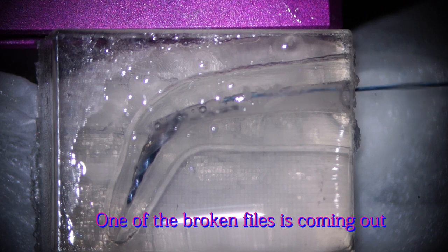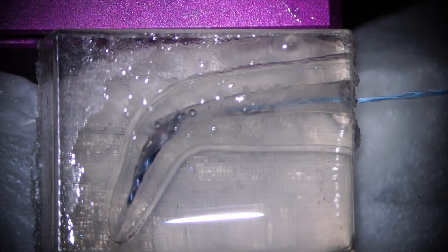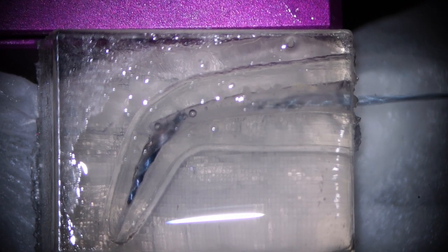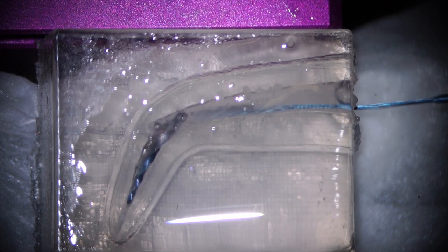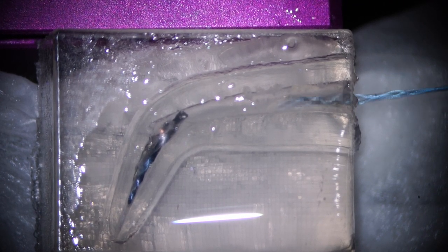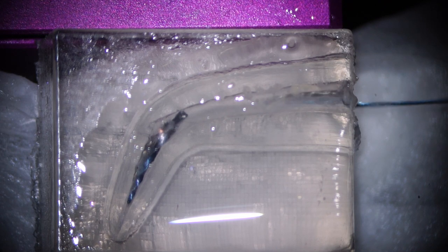So one is kind of loose already — it's kind of coming out, it is coming out. You have to keep doing this. The broken instrument is moving in a coronal direction, then it's coming out. Keep rotating the XP end finisher at 2000 RPM. It's already removed — it's floating, so you can just irrigate the canal and take it out. It's out of the canal.